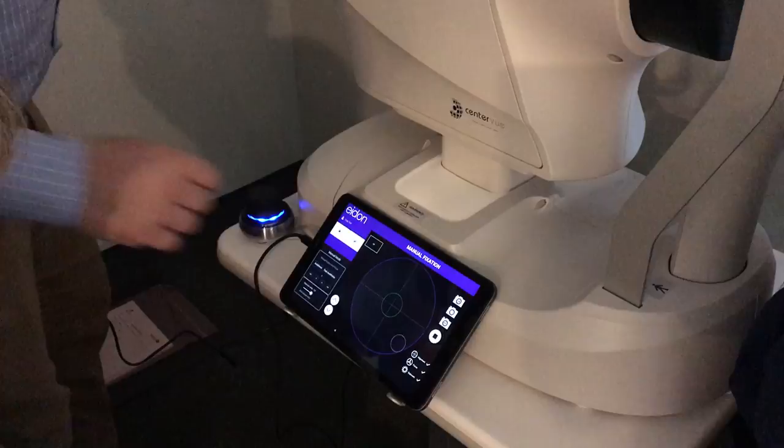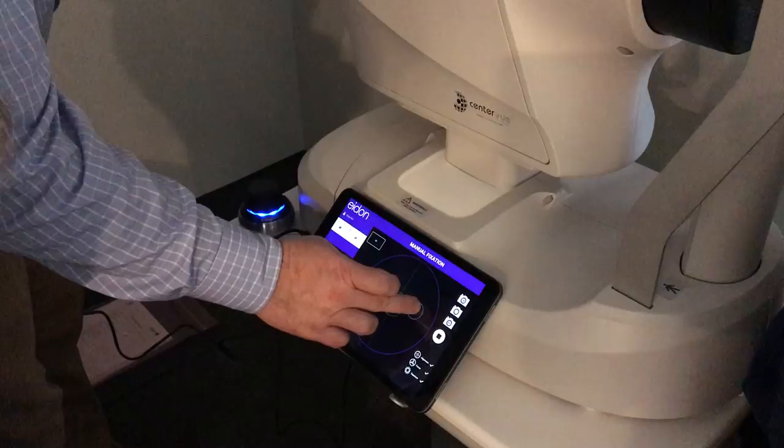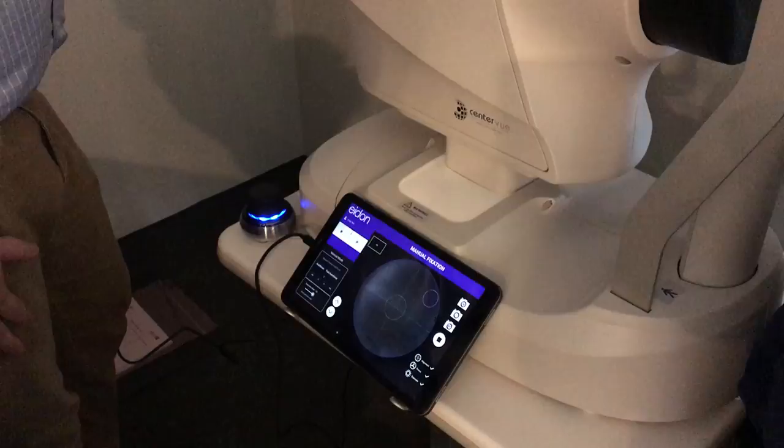And we're going to take one more. I want you to follow that light — it should be going down and to your right. So we're always going opposite: right and left are true, up and down are backward.